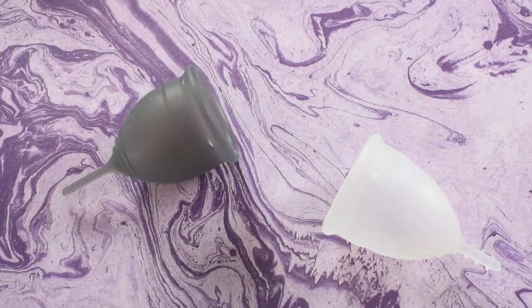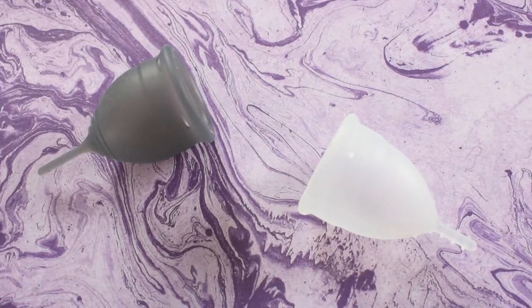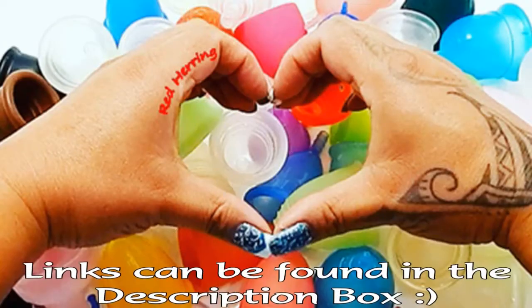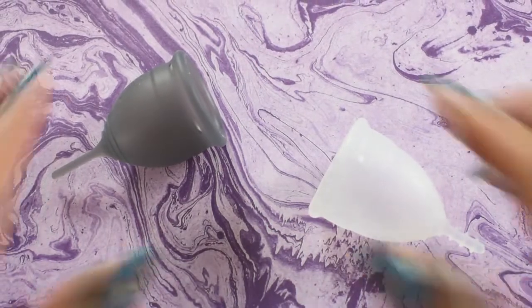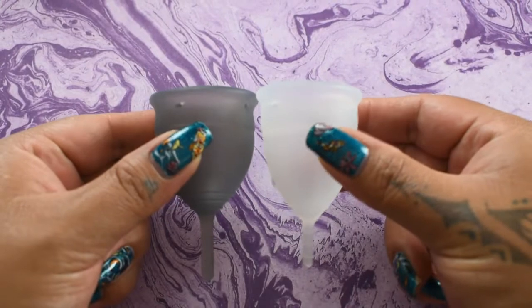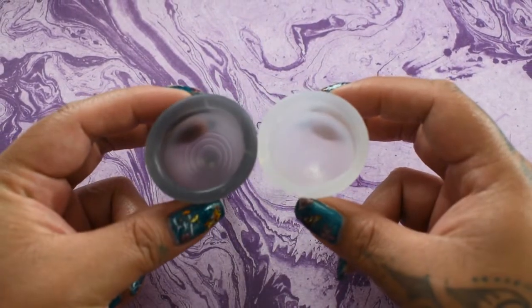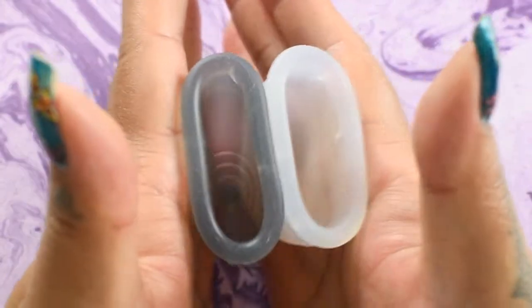This is a squish comparison between the Salt Cup soft version and the Organic Cup, both in a size small. I'm going to place both of these cups in the palms of my hands, give them a squish, swap hands, give them a squish again, and then compare the rims. Here is the inside of the soft Salt Cup.